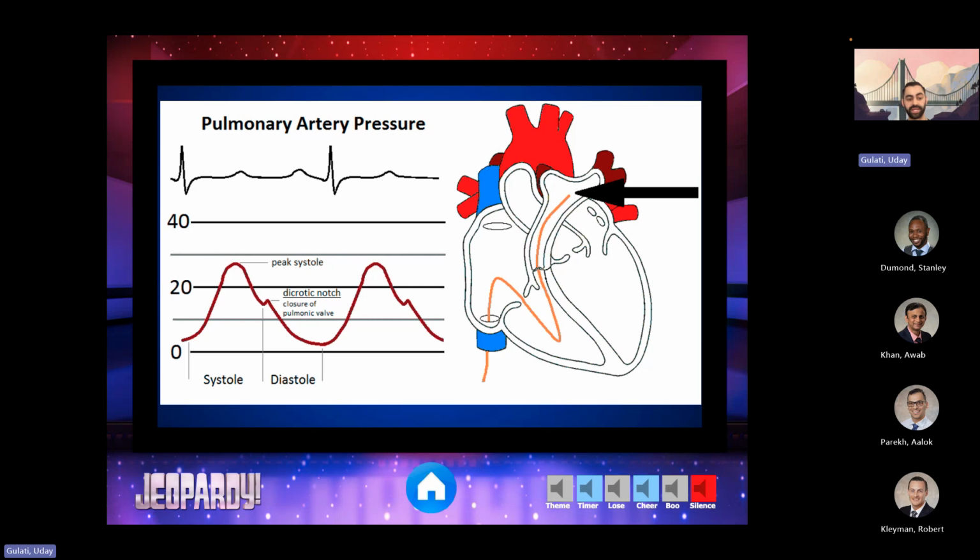So what you are seeing is the dicrotic notch, that small distinct dip seen in both the arterial and pulmonary arterial waveforms. The waveforms are pretty similar when you break it down. In the arterial line, it's indicating the closure of the aortic valve, and in the PA catheter, it's indicating the closure of the pulmonary valve. So if that notch is not there, you could have pulmonic regurg where the valve is failing to close, and so you don't see that pressure change from when the valve closes.